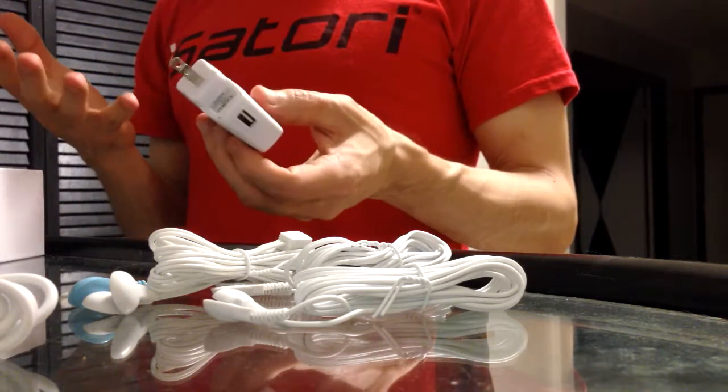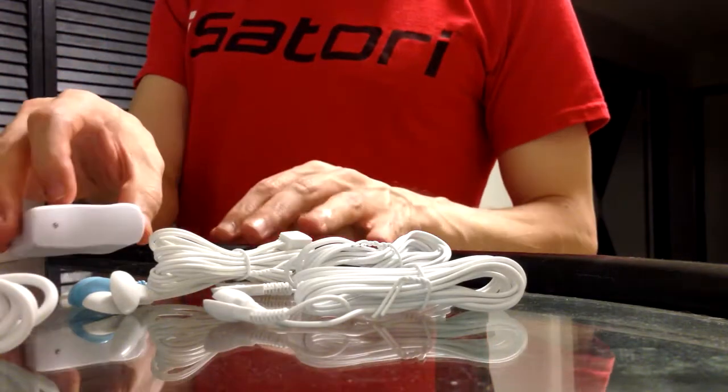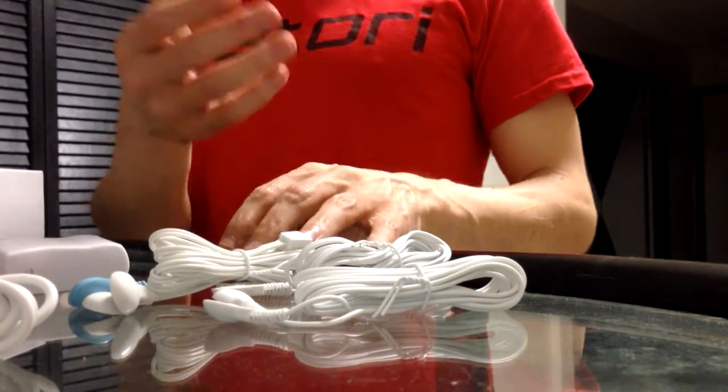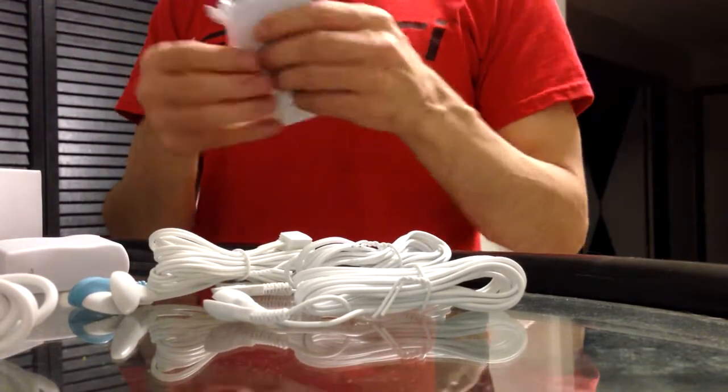I set something on this and then it caused the phone to fall — it's sitting on a Starkist can of tuna. And then there is even more pads — let's see what's in this.